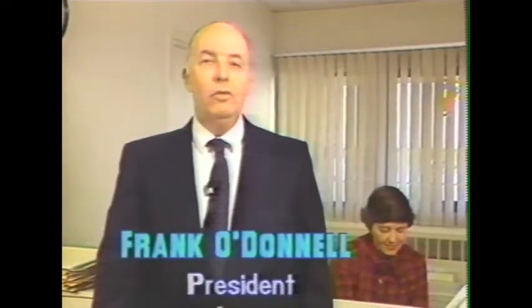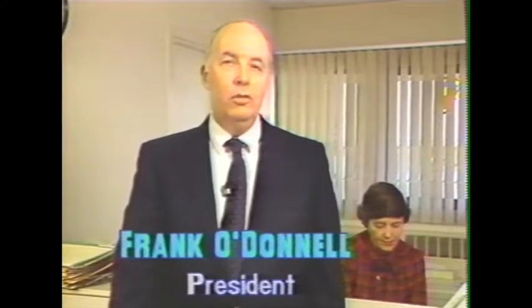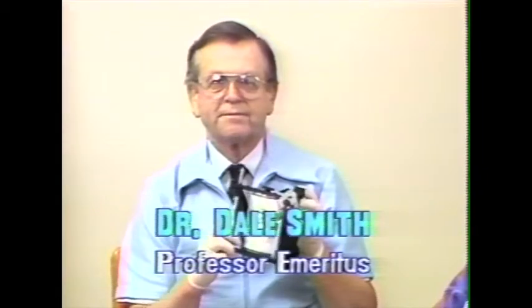I'm Frank O'Donnell from Teledyne Hanau, and I'm visiting with Dr. Dale Smith at the University of Washington Dental School. With his cooperation, we are going to demonstrate the application and the benefits of the Hanau Spring Bow and the Modular Articulator. The purpose of an articulator is to simulate jaw movements.